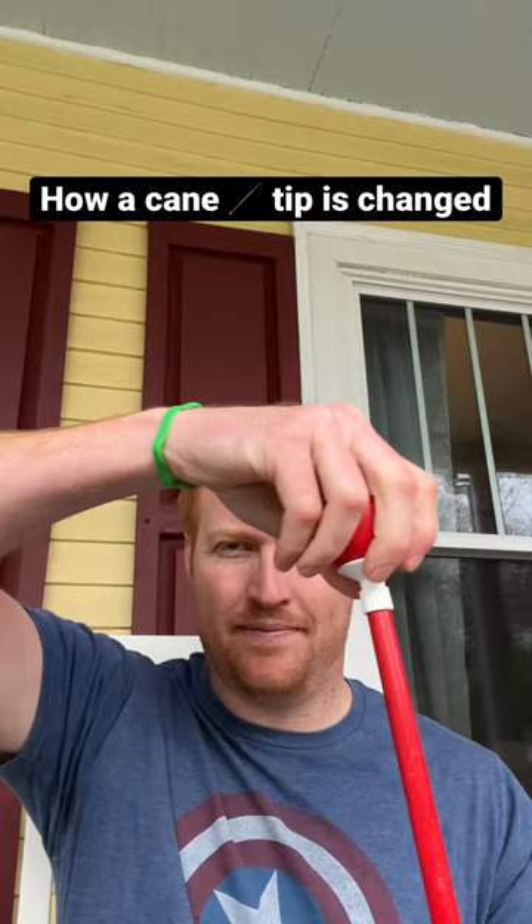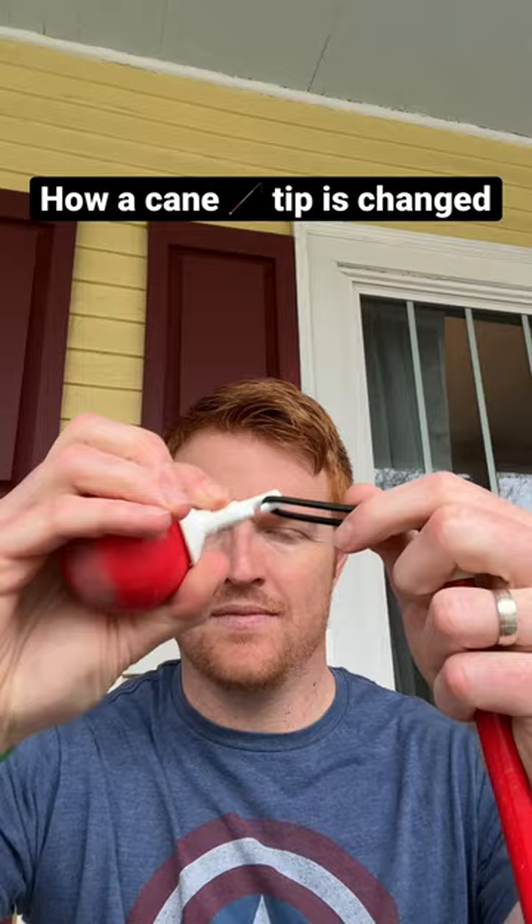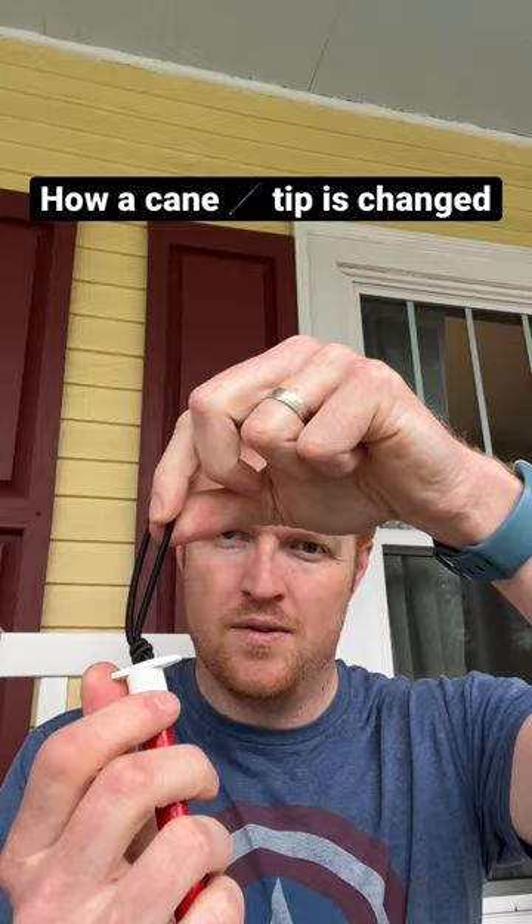First, the old cane tip that's going to be removed is pulled up out of the cane and unhooked from the elastic cord at the bottom. There's a little white stopper here that prevents the cord from shooting back up into the cane.